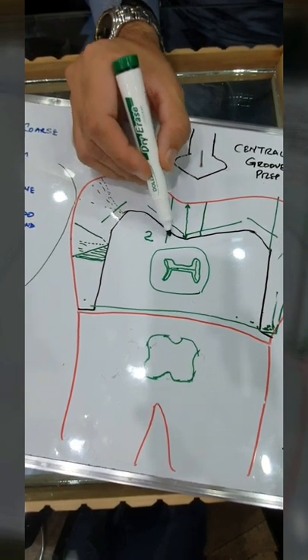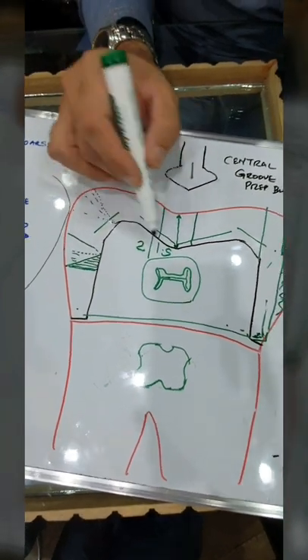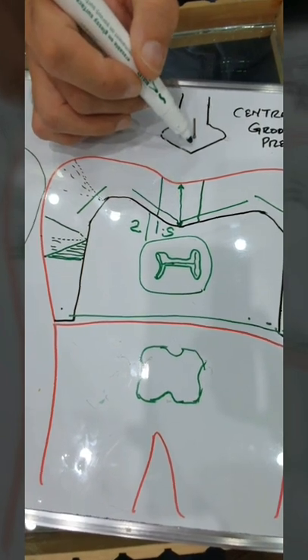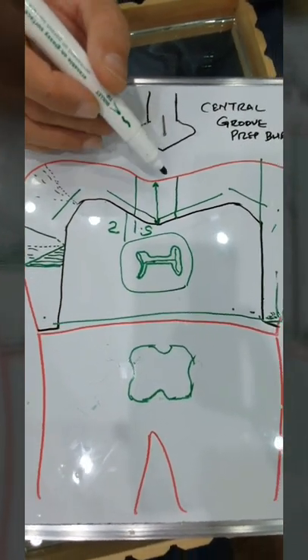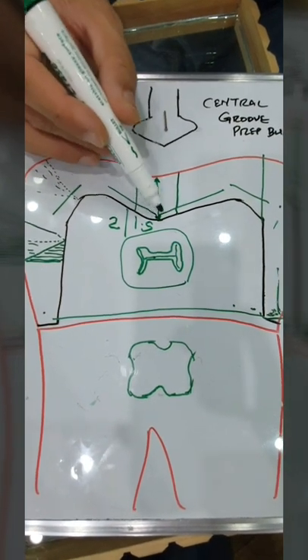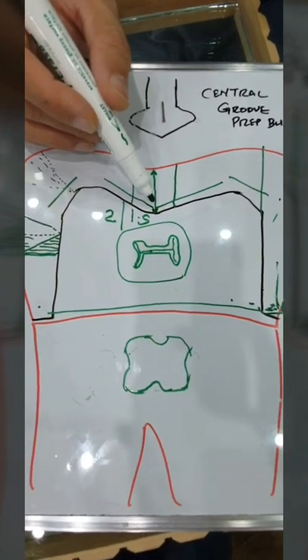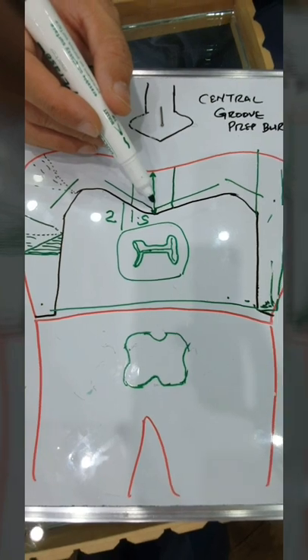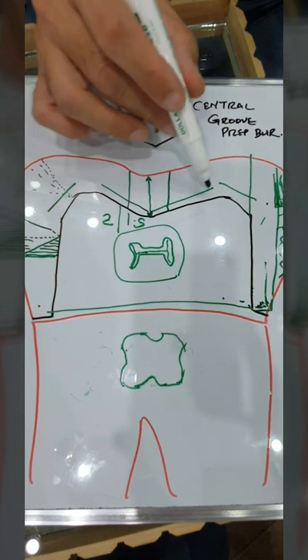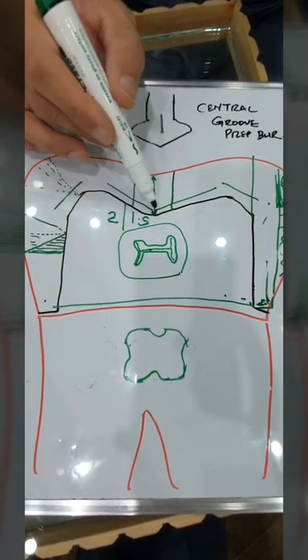At the non-functional, it could be 1.5. I'm writing upside down, so I do not know if the numbers show right. But wherever you are, if you're unsure about the depth, then go ahead and use a regular diamond or carbide burr that you use for your class 1 restorations, and do the class 1 preparation, and that way you'll know exactly how deep you are in the central groove, so the ambiguity is removed and you'll have a surety into the crown prep. And then you go ahead and connect those 2 points together, and you should get very nice depth on the occlusion in the central fossa.